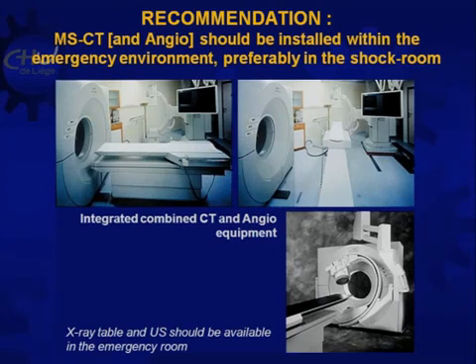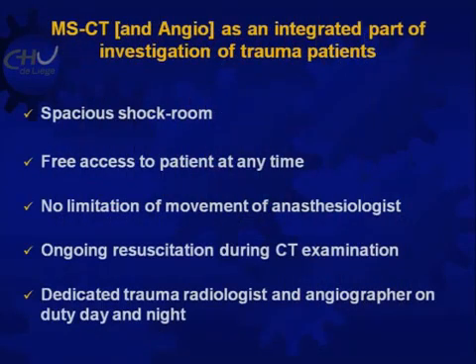So my recommendation would be that you have a very spacious shock room. It should be 60 square meters. 60 square meters you need. And free access to the patient at any time, whatever the imaging modality is that the patient is just undergoing. And there should be no limitation of movement of the intensive care physician, the trauma surgeon, and the anesthesiologist, of course, to the patient. And the message now is, with the rapid time of examination of CT, both procedures are going together, resuscitation and the CT.